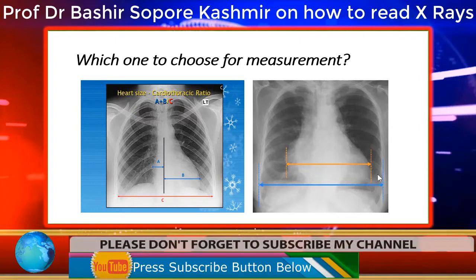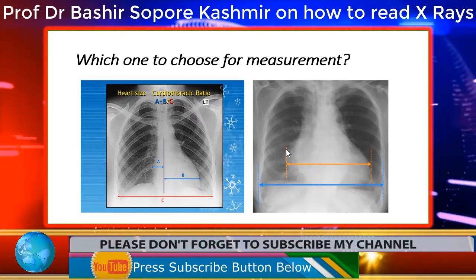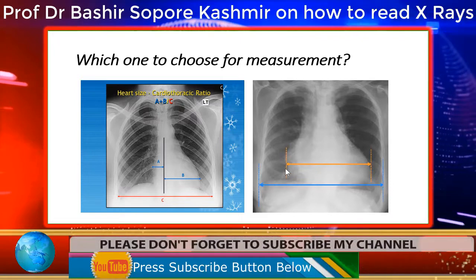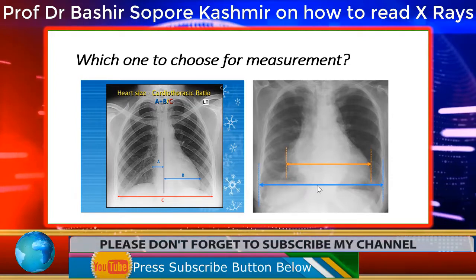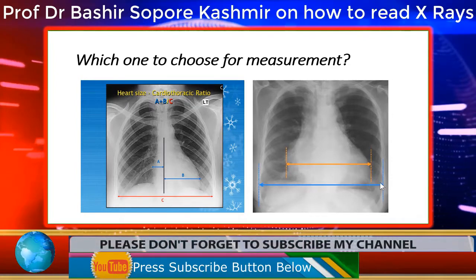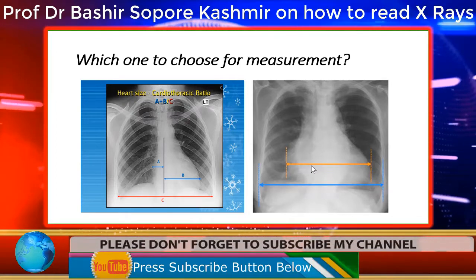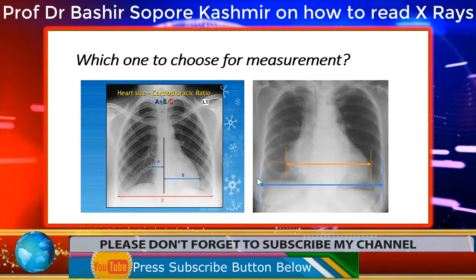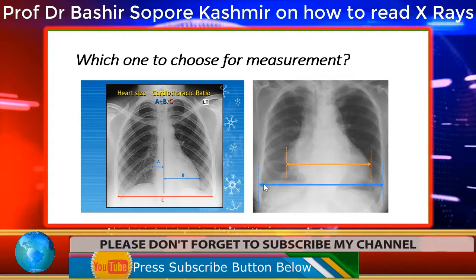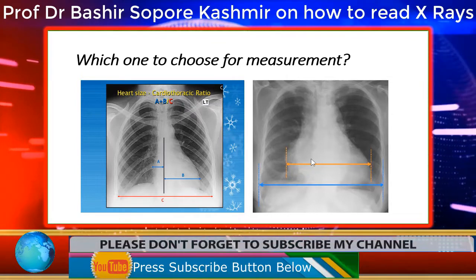Now I want to ask you here one question. Will you measure this way or will you measure this way? Now here also, if we take the maximum distance of the heart, that is this point to this point, and we take the maximum distance across the chest wall, and we find that the cardiothoracic ratio is more than 50%, then we say the heart is enlarged. So this distance divided by the distance across the chest wall. If it is more than 50%, we say there is cardiomegaly.